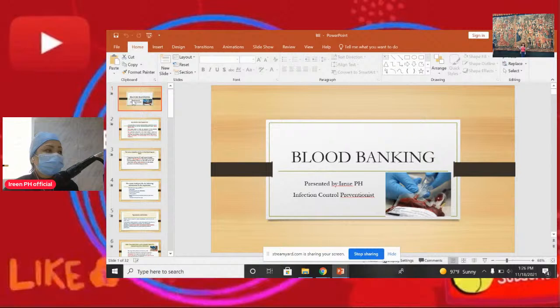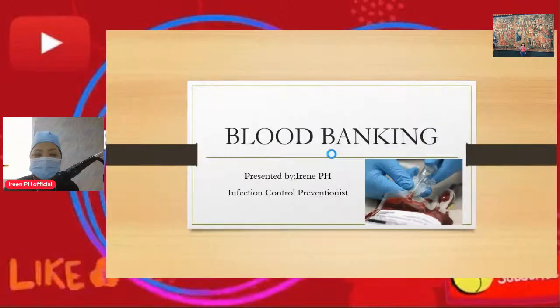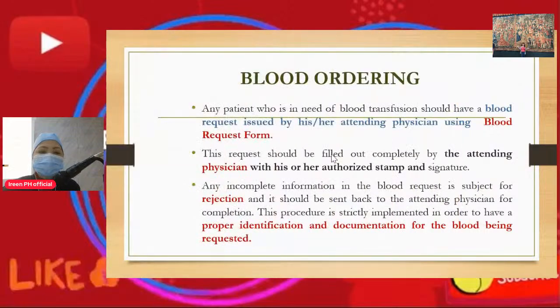Okay, let's begin. Any patient who is in need of blood transfusion should have a blood request issued by his or her attending physician using the blood request form.